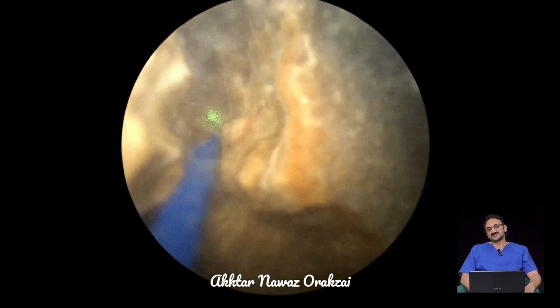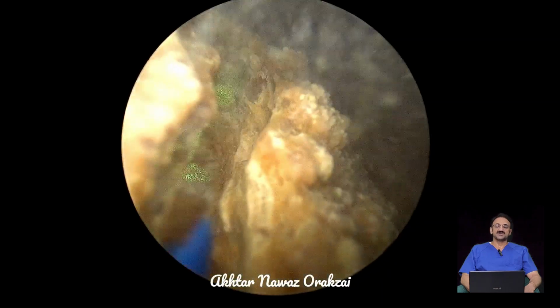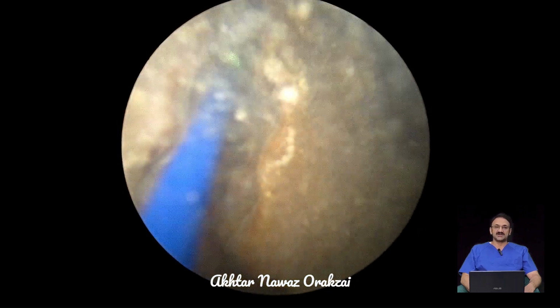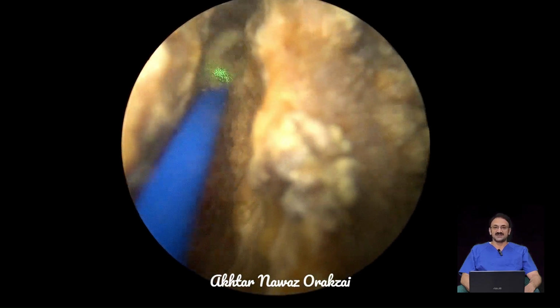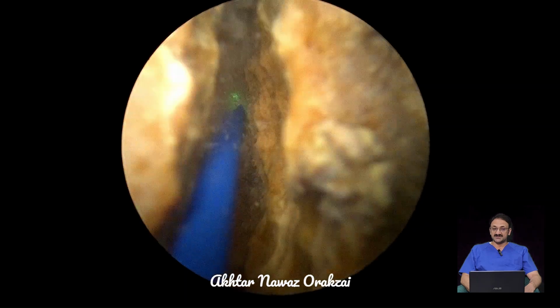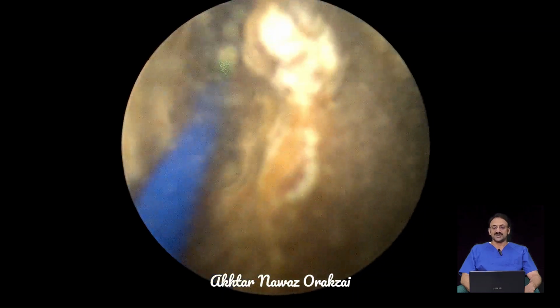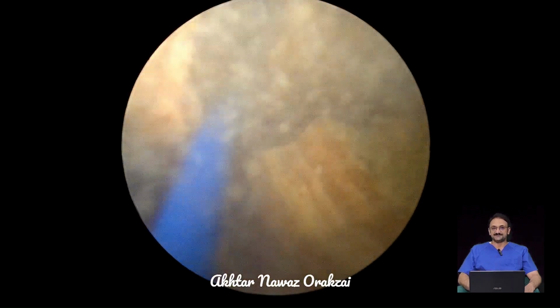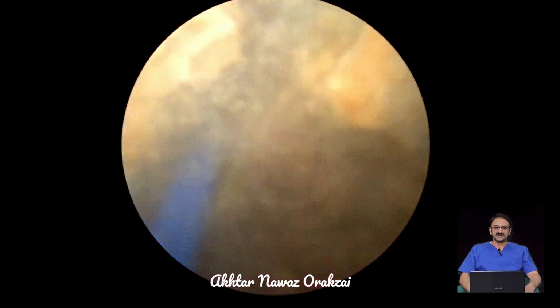When we performed the cystourethroscopy, it turned out that there was a highly occluding prostate with a median lobe as well as lateral lobes, and the bladder was mild to moderately trabeculated, and the stone was extremely rounded, and there was no way that the stone punch could catch it. So instead of going for a percutaneous cystolithotripsy or even open vesicolithotomy, we planned to fragment the stone into 4 or 5 pieces of such a structure that the stone punch can grab it.